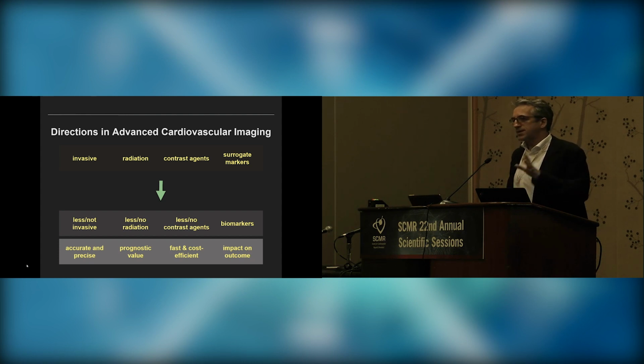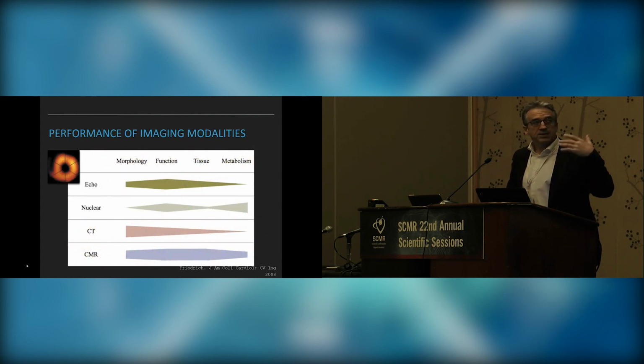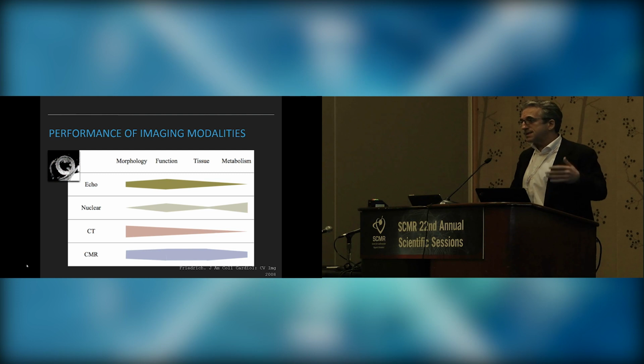And believe it or not, some of this information is not even available for techniques that have been around for 20 years and are a source of making a lot of money, especially in North America. So that's the general direction. And as I said, none of the techniques is perfect. But if there's one technique that's coming pretty close to all that, then it's MR, because it doesn't require radiation.